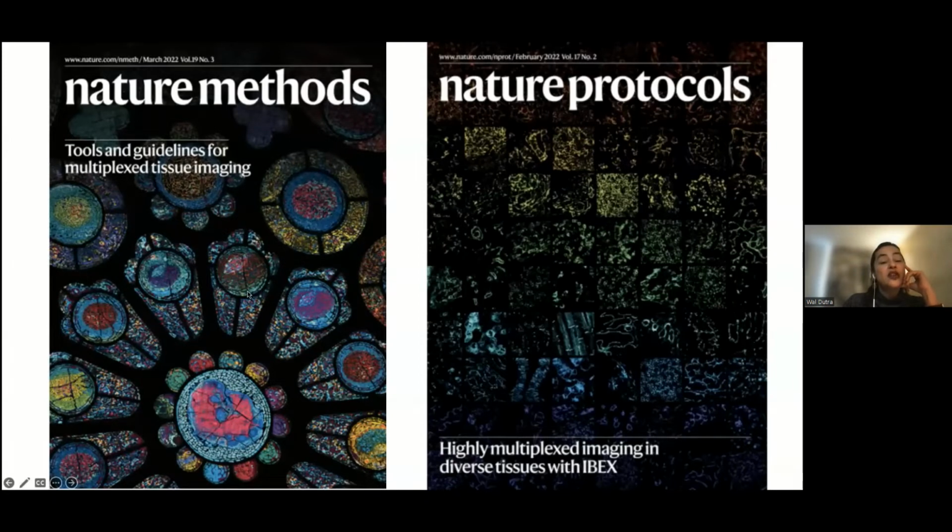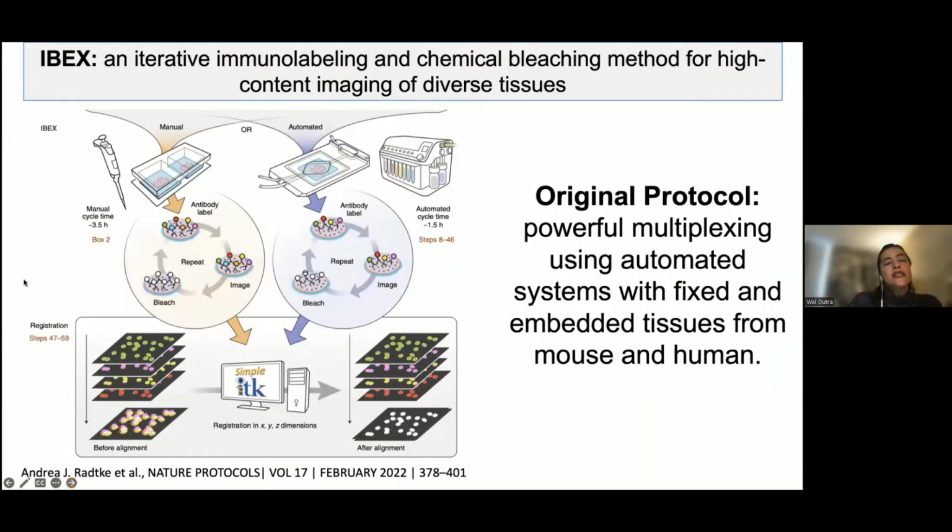And these are essentially fluorescence images. This is obviously not true. She made sort of like a church window or something like that. But these were images that she acquired using a methodology that allows you to do multi-parameter analysis in tissues, in different human and experimentally derived tissues. So once we came across that methodology, we were very interested in seeing if we could apply it for our needs here in Brazil. So what is this methodology?